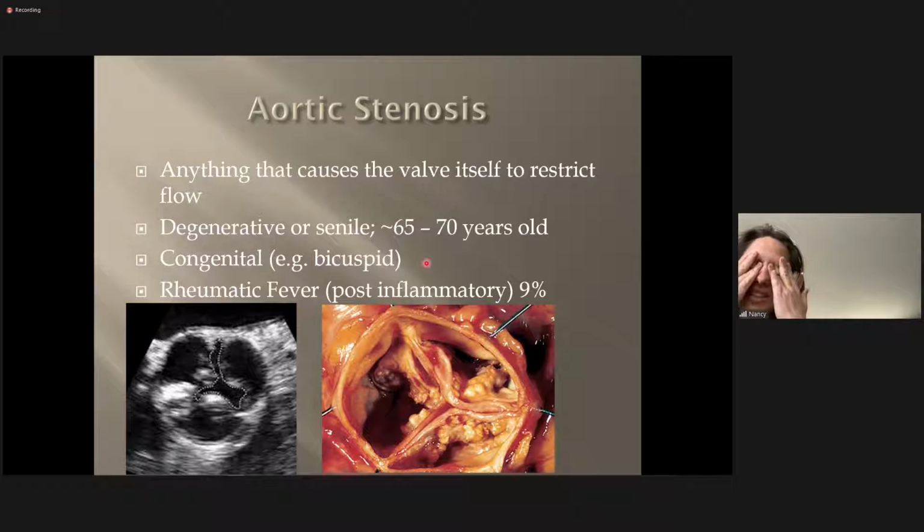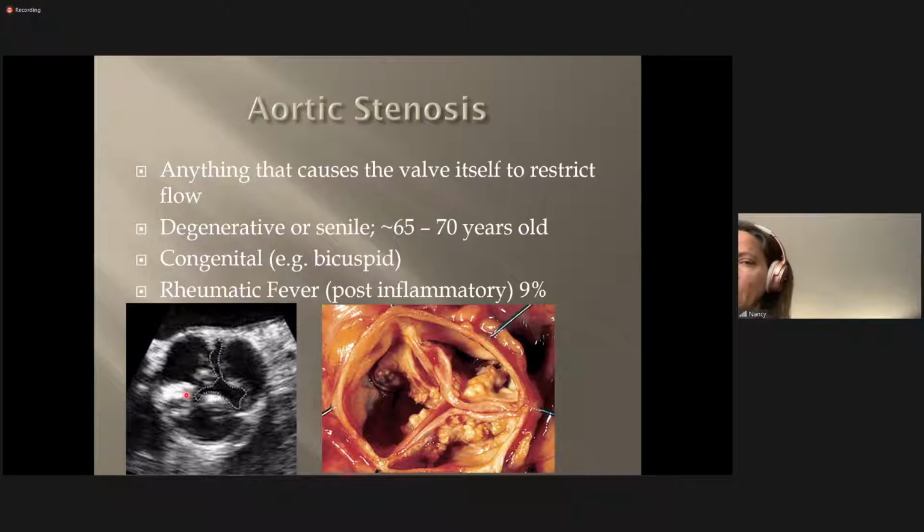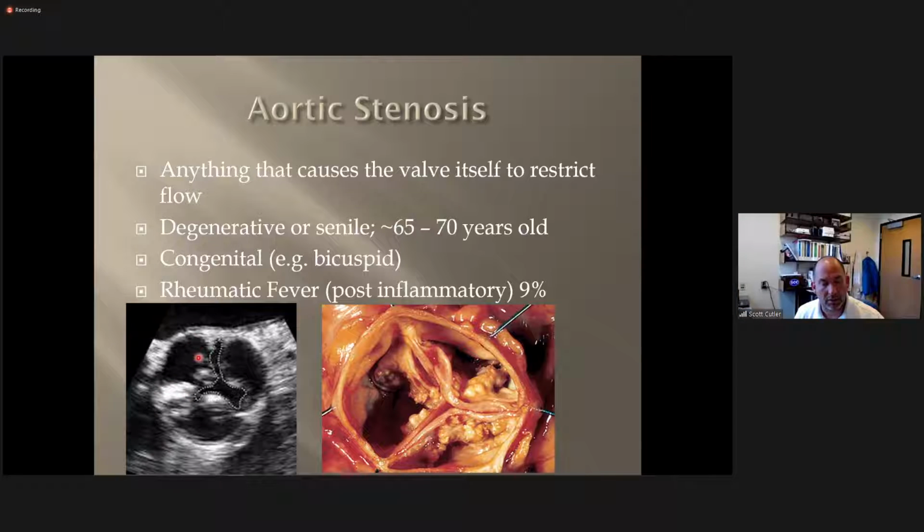Nancy, why is the calcification showing up black? I thought it would shine white. Well, they are white, these are the calcifications here. This black space here is just the fluid, because remember the cusps are kind of cup shaped and we're only seeing the tips of them here, not the entire valve. On the tracing, they're not tracing a calcification. They are tracing the opening of the valve. That's fluid, so this is where it's not coapting.